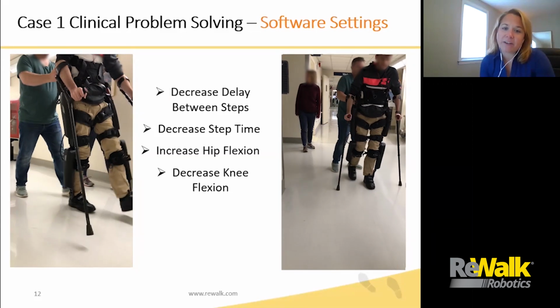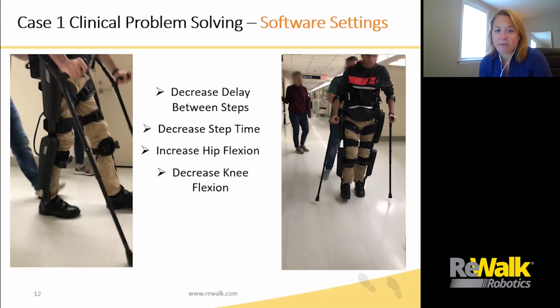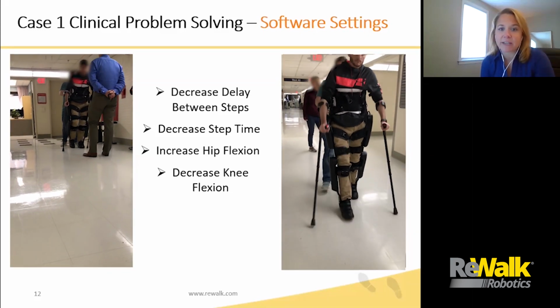The therapist, so now you can see he's just hovering his hands over the back. They were sort of contact guard by the time we finished that session.